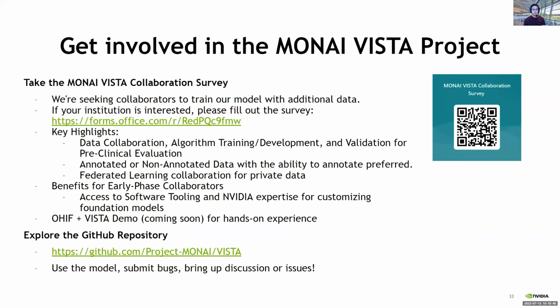So the last thing I wanted to leave you with is that for MONAI Vista, we have two different things. One, just like Dave said, is that it is publicly available as of today. If you do a Google search for it, you probably won't find a lot about it. But I did put the links both in Discord and in the Zoom chat. So take a look at it there. It's also here: if you go to github.com/project-monai/vista, you can find everything they've been talking about today.